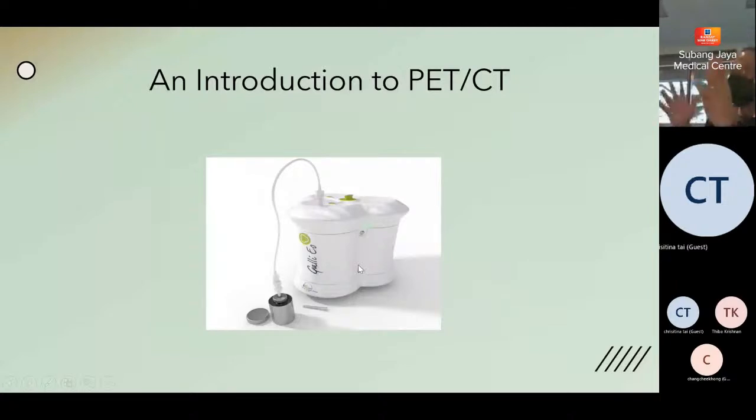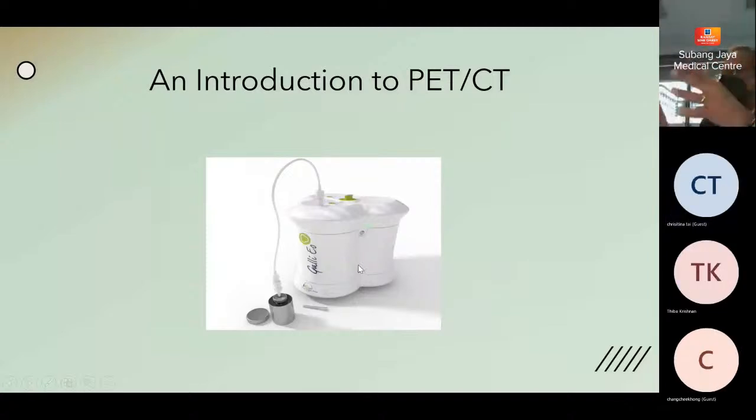Produce a lot of radiopharmaceuticals, and you must understand that radiopharmaceuticals used in PET have a very short half-life. So we had to go and essentially order a lot in order to do a few patients. And that's very inconvenient, it's very costly.